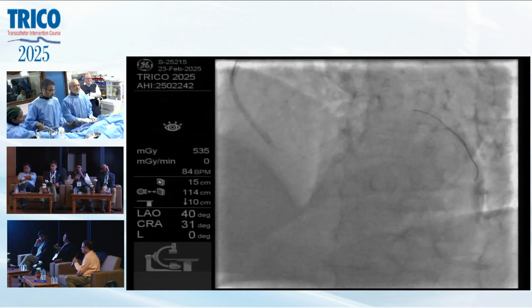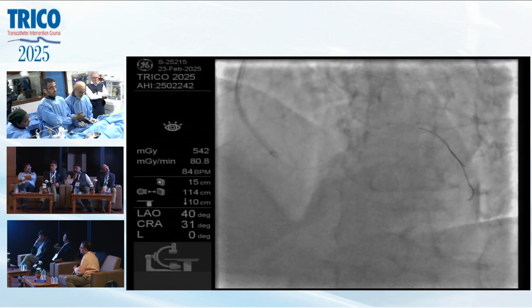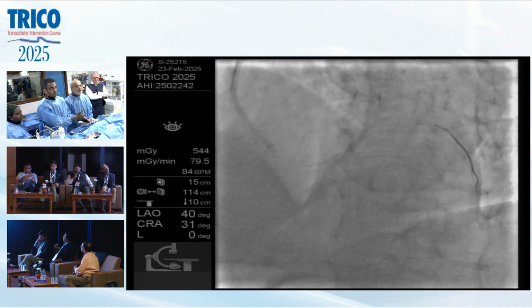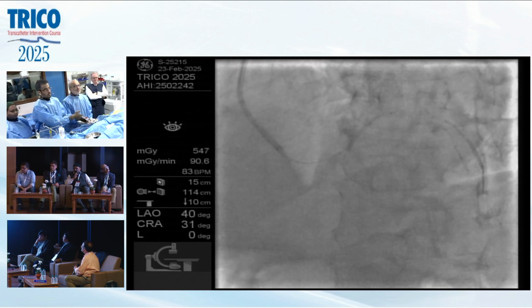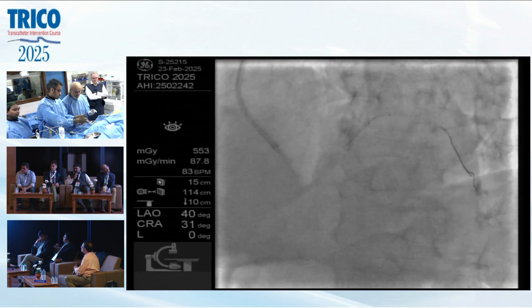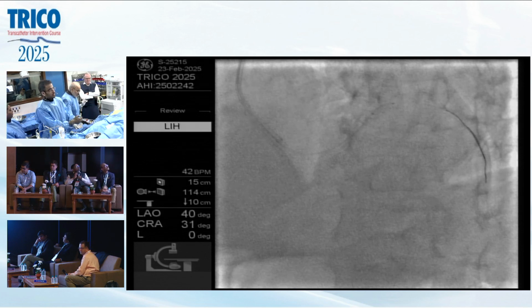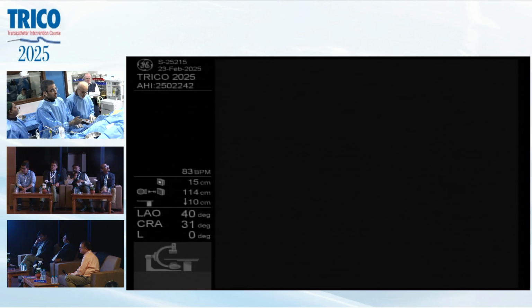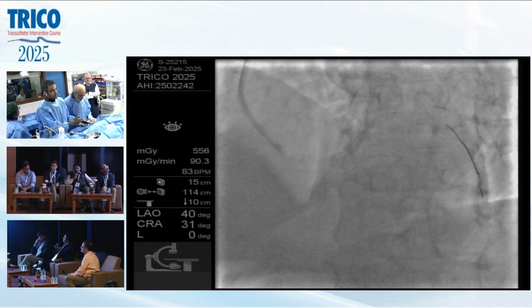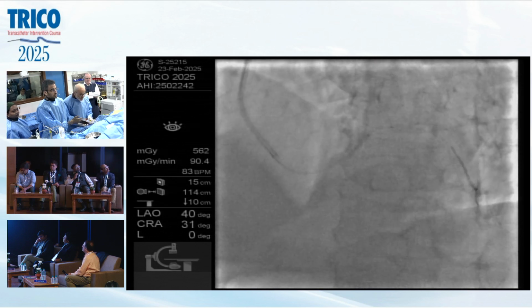Yes. The most important thing is deep intubation in this particular scenario, because we need some support to push the stent. Here I agree, Ajay. So if I will trust only one guide catheter for my deep intubation purpose, that is right Judkins. Every single guide catheter which has a different shape can create problem when you want to really go deep. So I'll prefer 5 French guiding in this type of scenario. Only issue is the lesion is very long.